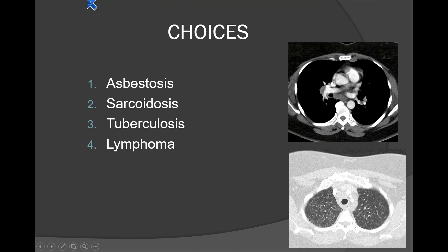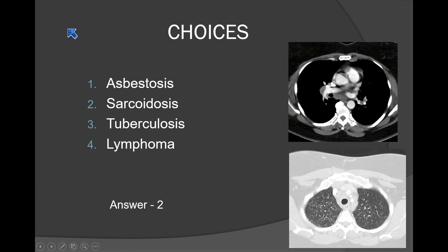Is this asbestosis? Is it sarcoidosis? Is it tuberculosis or is it lymphoma? There are a couple of possibilities here. Audience responses include TB and sarcoidosis.